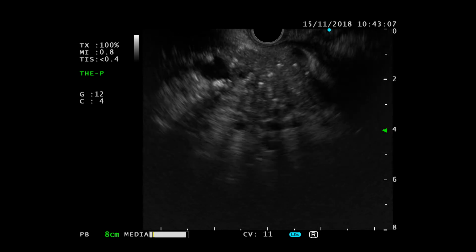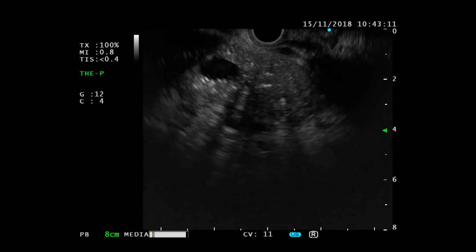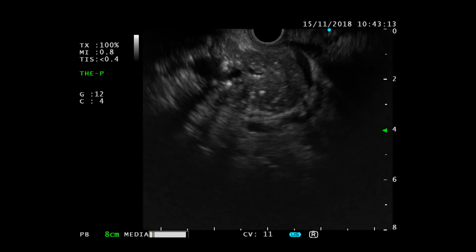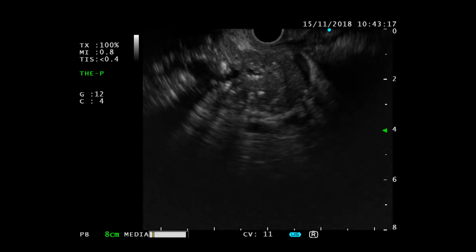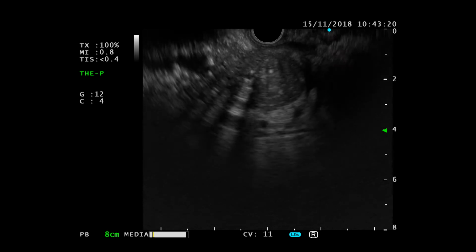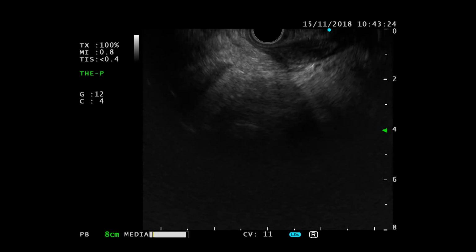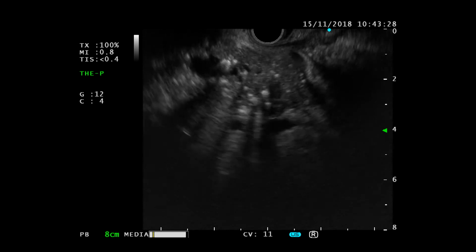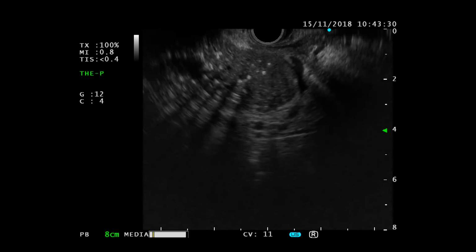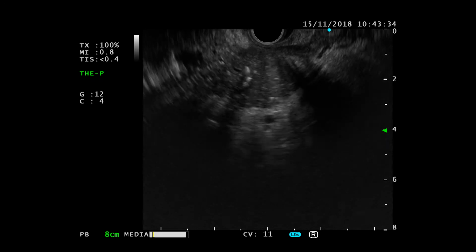Do you think that contrast enhancer, the EUS, may be of any use here? Yeah, I think Thomas, it might be worth doing because there is that area which is slightly different to the rest of the pancreas. You know, Pietro might disagree, but where contrast might help, if there is a specific area of hypoenhancement, we could target that part of the pancreas.